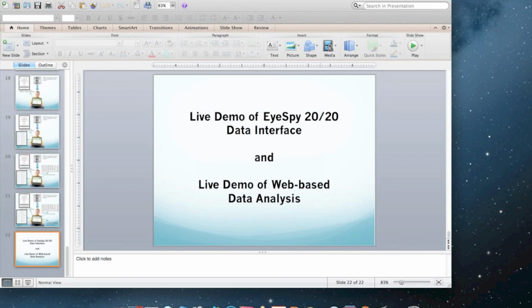So there's not a need for us to sit around any longer and talk about, well, should it do this? Should it do that? What about this? What about that? Look, we need to start vision screening every child now. And what we will do, be rest assured, is not, again, I'm not talking about we Vision Quest, I'm talking about we collectively as a vision screening community will adapt and evolve to meet the needs of either policy requirements or individual states' needs or whatever the case may be.